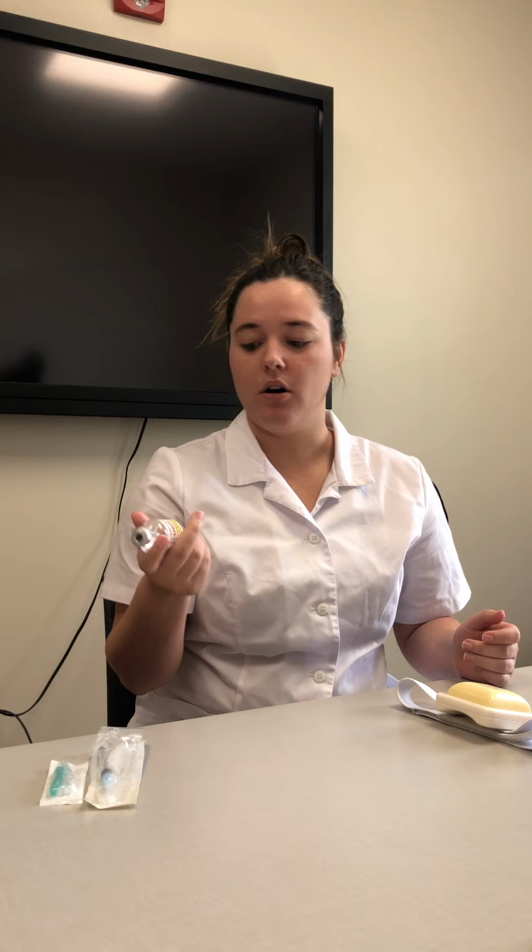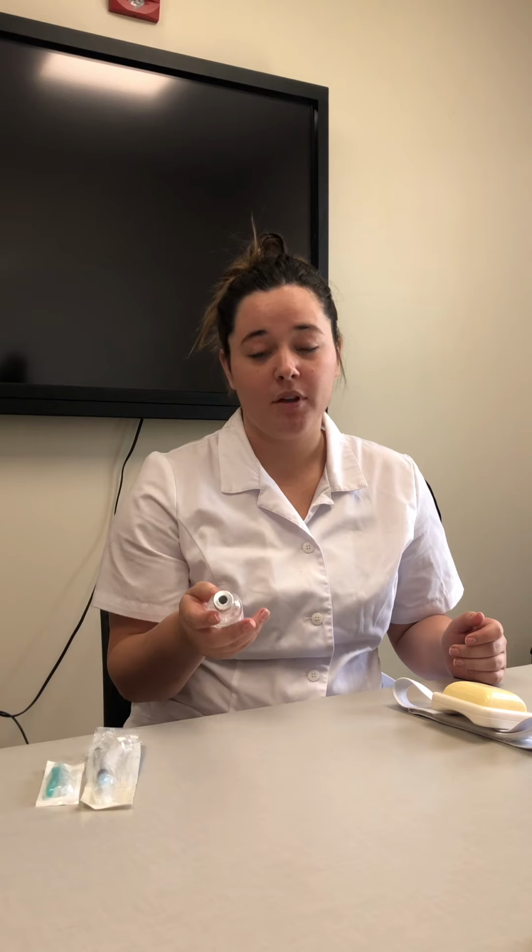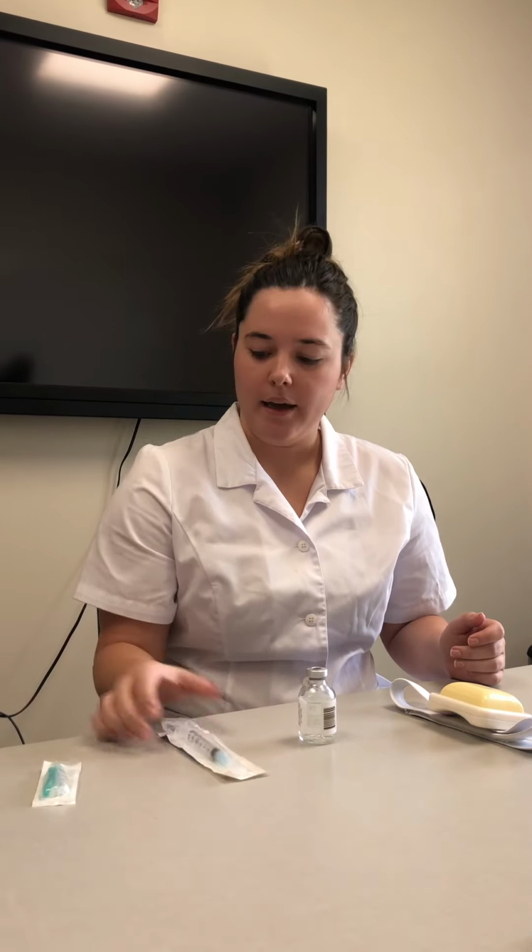And so here I have the Haldol, and this is 5 milligrams per milliliter. So if the doctor is ordering 4 milligrams every 6 hours, and this is 5 milligrams per milliliter, then that would convert to 0.8 milliliters. So I have my medication, I have my needle, and this is a 21 gauge needle, and I have my IM needle. So my intramuscular needle is about an inch and a half long. And that's how you would distinguish that it is an IM needle.